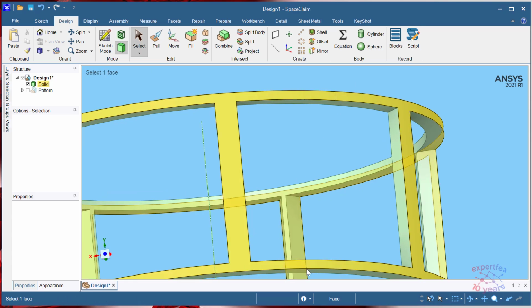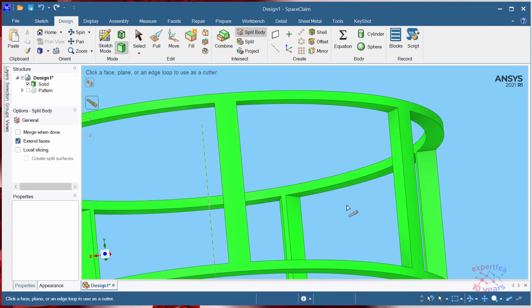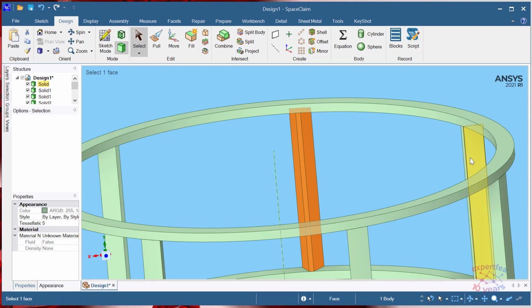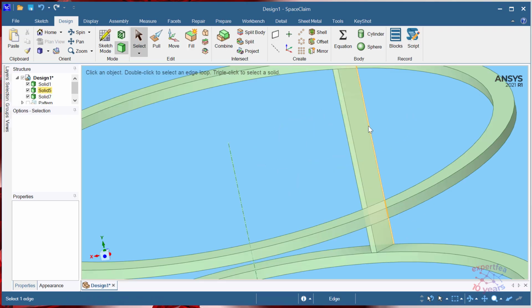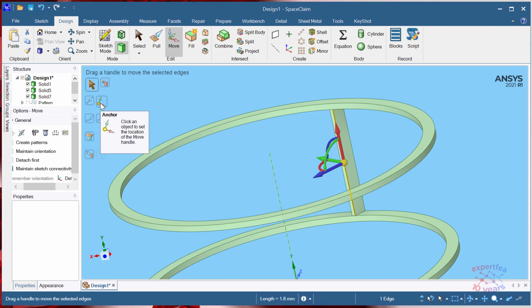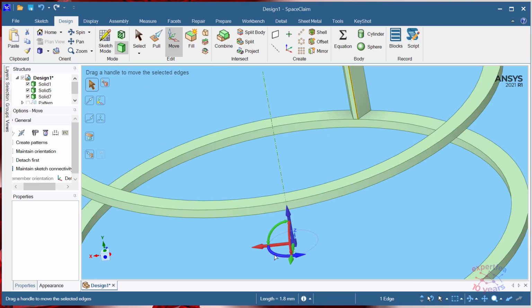You know what, let's separate only this strut, or small beam. Split body, I will split this body about this face. This means that all the struts are separate bodies now, yeah? Let's delete all of them except one. I will click this edge and I would like to move it circularly, let's say. I have move, I will change the anchor or the reference for the movement to the axis. Then it will ask for an angle.